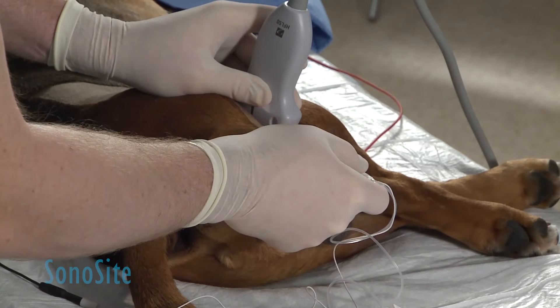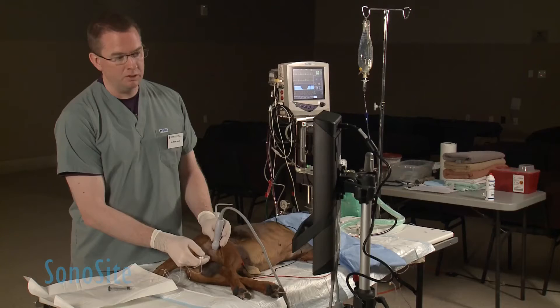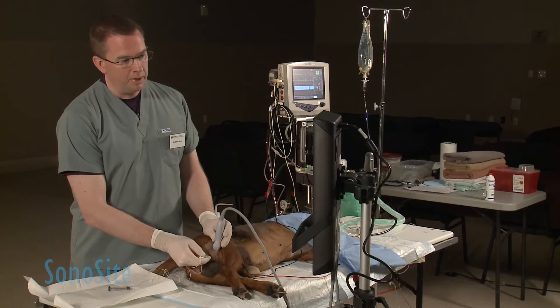Once the needle is placed adjacent to the target nerve, we see twitches corresponding to the stimulation of the two components of the sciatic nerve. Once we get to that point, it's a matter of using very fine manipulations on the needle.